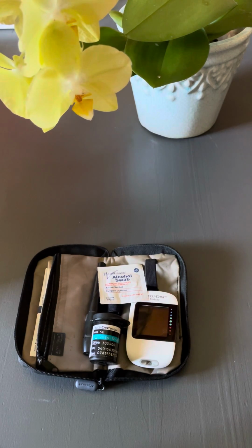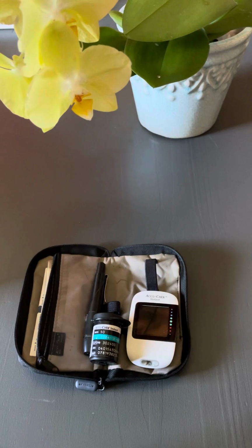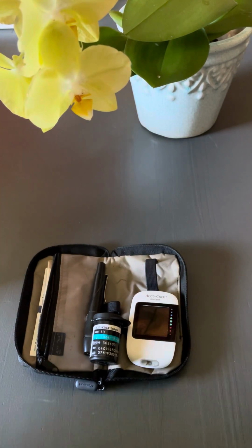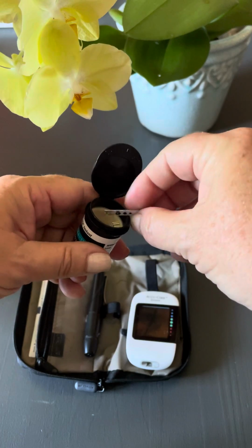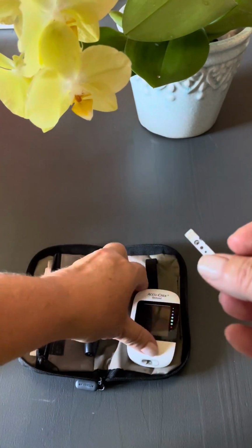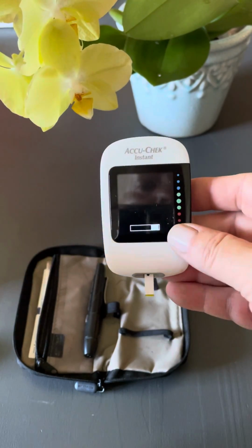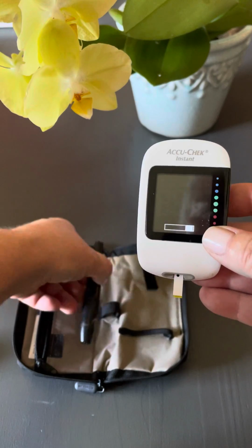In this video I'm going to show you how I check my blood glucose using an Accu-chek glucometer. So I use an alcohol swab, and with this I clean one of my fingers. When I've done that, I usually put one of the measuring sticks into the machine, and that will indicate then that I can put the drop of blood on the machine.